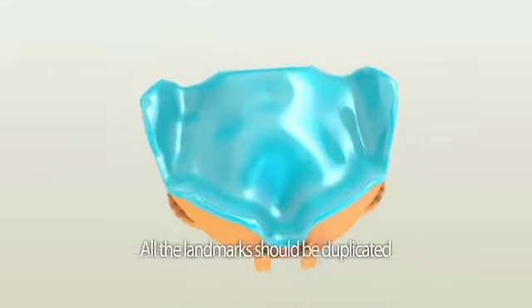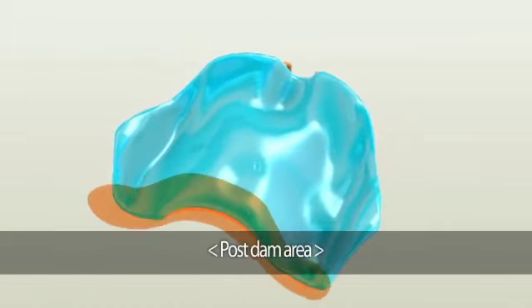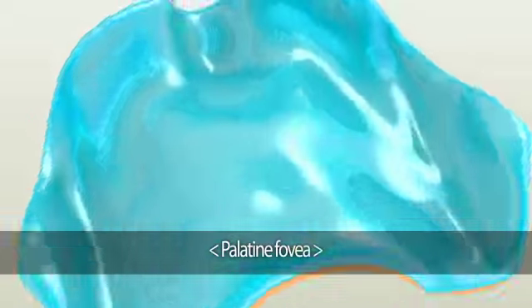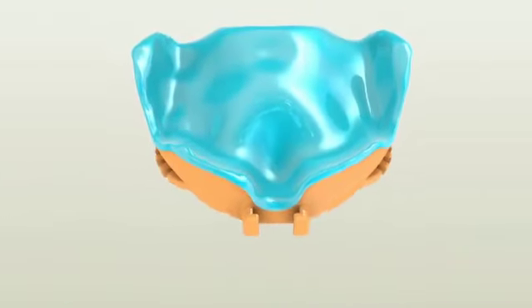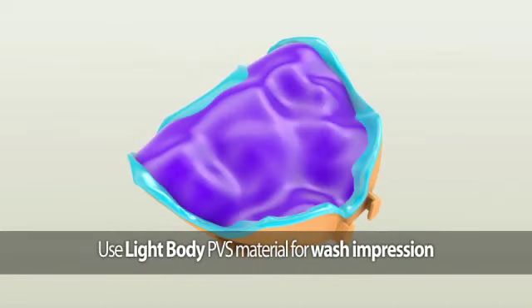The second area to check is whether all the landmarks are duplicated. This includes the post dam area, hamular notch, palatine fovea, incisive foramen, and the frenum areas. To make the wash impression, we recommend using fast-setting light-body PVS material such as Flexi-Time Fast and Scan.